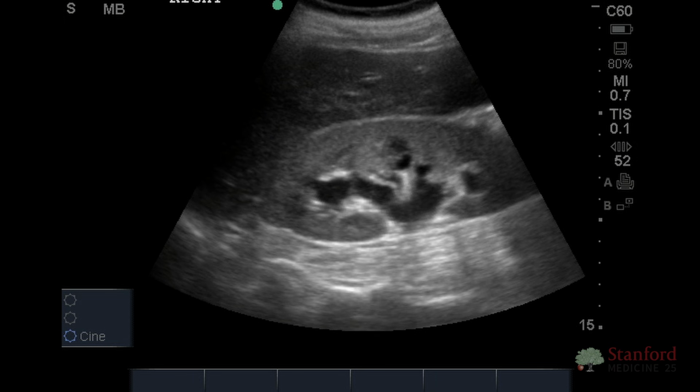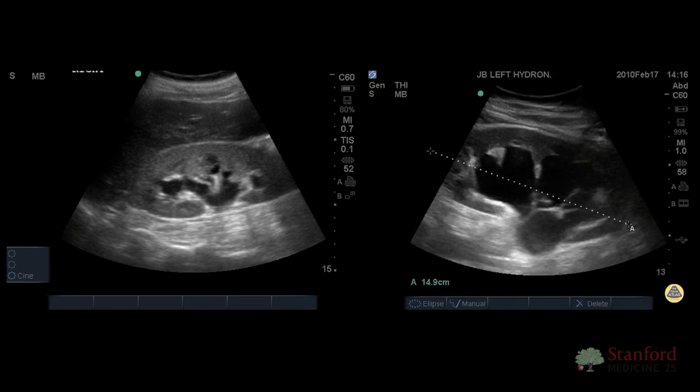Another common pathology that you can look for is hydronephrosis. With hydronephrosis, the center of the kidney, the medulla, is replaced by black fluid. There can be various degrees of hydronephrosis, ranging from very mild to more severe, as we're showing here. Keep in mind, in patients with very severe hydronephrosis, the kidney almost appears like a giant cyst, and it may actually be difficult to discern this. Practice is always what's needed to be able to distinguish from a more mild to moderate to severe disease, although we don't quantify that in point-of-care ultrasound.